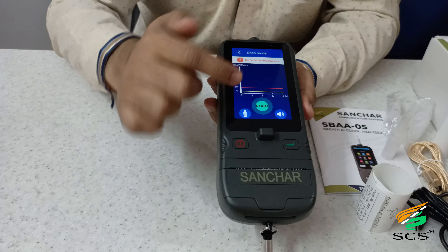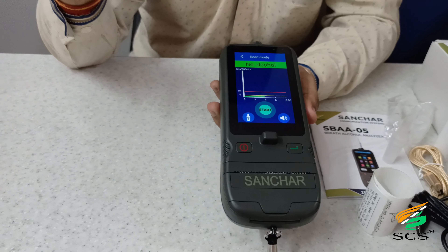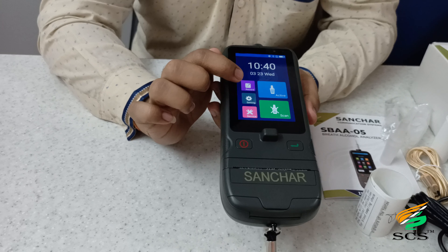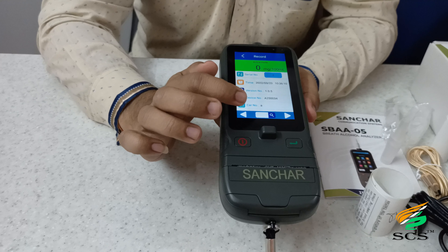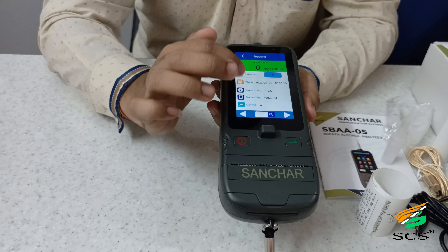For scan mode, remember you do not need a mouthpiece — just click on start and it will show the result. If you want to see your previous records, click on the record option. You can check recorded data using the navigation buttons. In the record option, the device can save up to 1 lakh records.